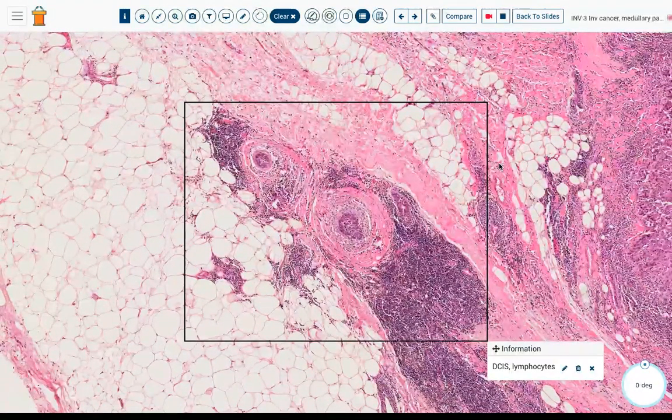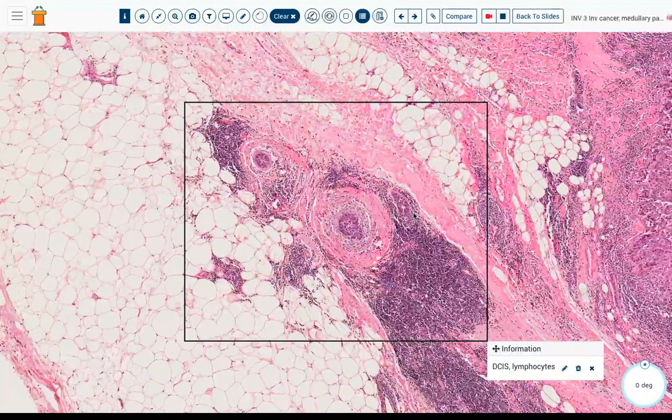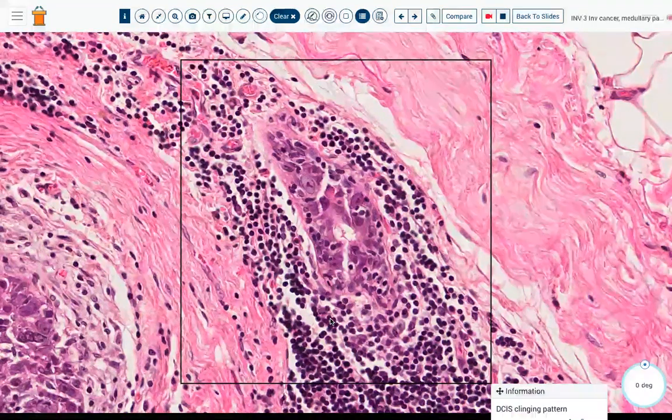Now, the DCIS that may be associated with these medullary feature cancers can be quite subtle, and this is also true for other triple negative cancers because these are a form of triple negative cancer. So, way out on the side of this cancer, you can see these little areas here. You can see the lymphocytic infiltrate, and that's usually a giveaway. Somehow the lymphocytes know where the DCIS is, but you could easily pass over this. It's only when you look at high power that you can see the high grade tumor cells in here. And triple negative DCIS often presents as a clinging pattern and can be hard to appreciate unless you're looking closely for it.